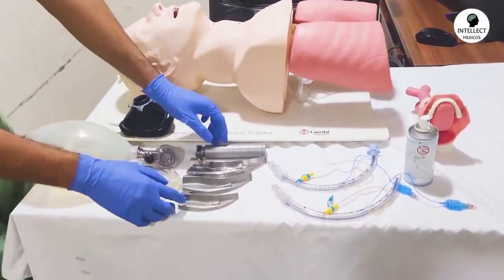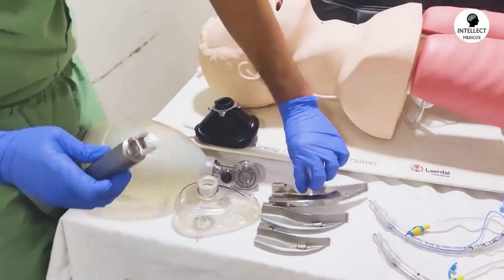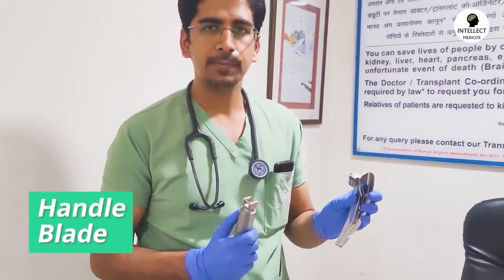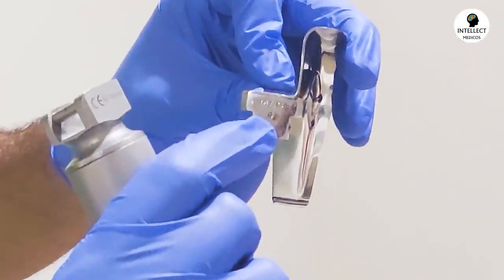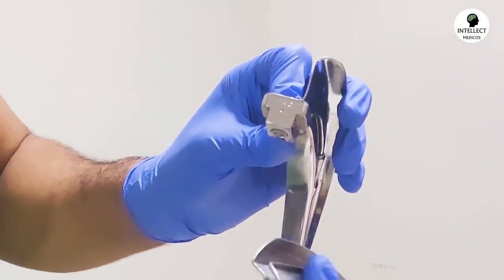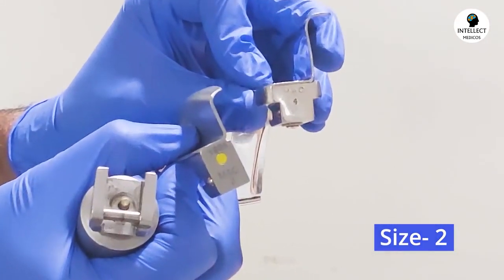These are different sizes of laryngoscope, mainly the Macintosh laryngoscope. Now I'll show you. This is the handle of a Macintosh and this is a blade. And you can see the sizes are written over here. Mac, size number 4. So there are different sizes. You can see size number 3 and the other is size number 2. Can you see it?